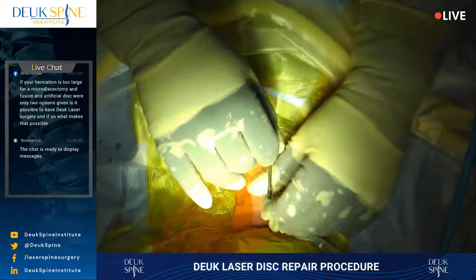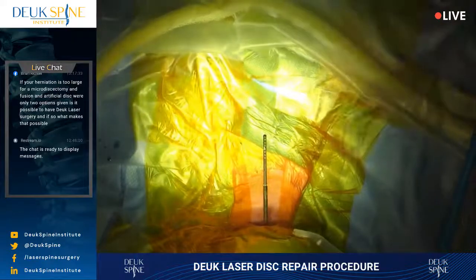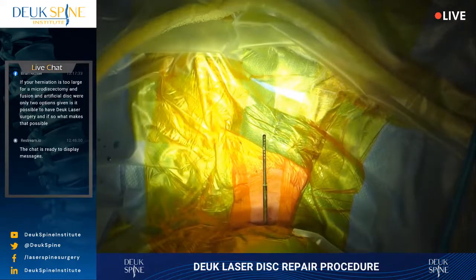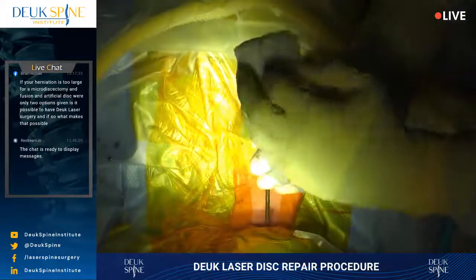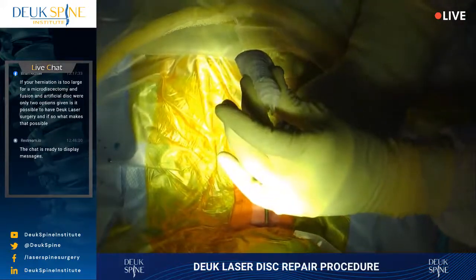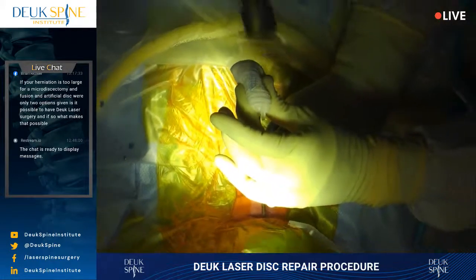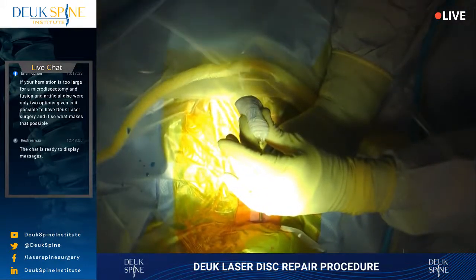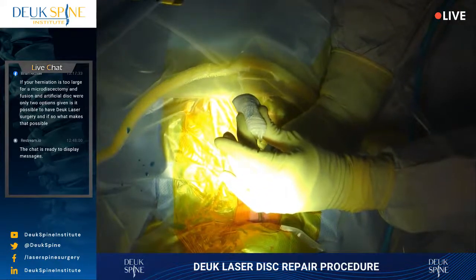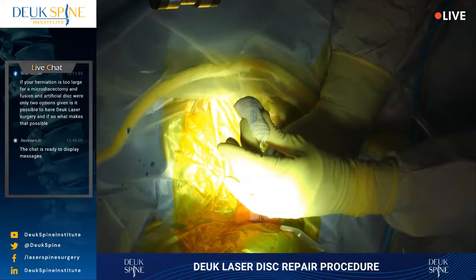I did not pioneer the first transdiscal endoscopic cervical surgery. That was done probably by the South Koreans. Nobody really knows for sure who did the first one. But what I pioneered was the technique where we debride the annular tear at the back of the disc. And in doing so, we eliminate the neck pain and headaches and arm pain, arm symptoms called radicular symptoms.